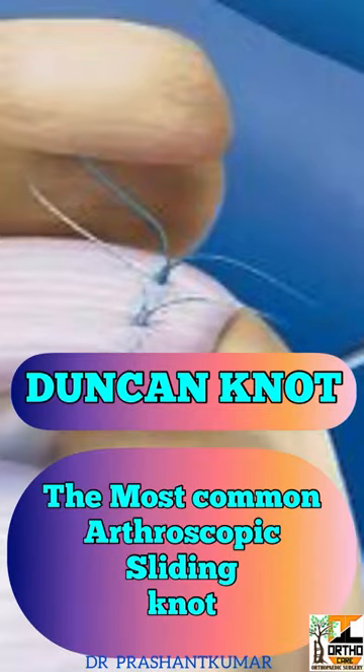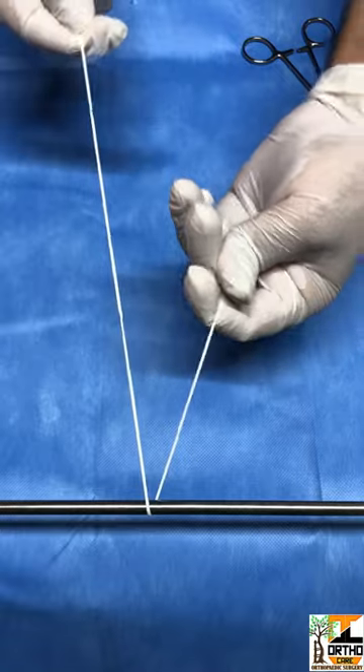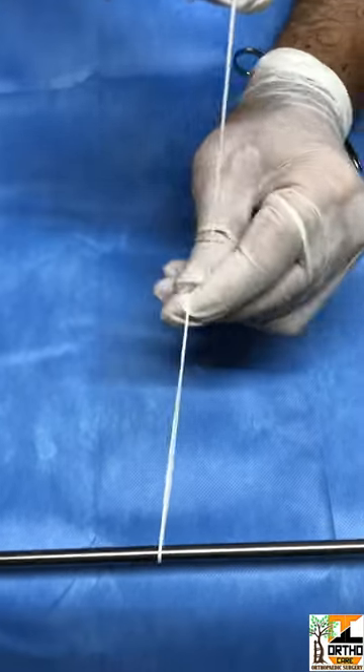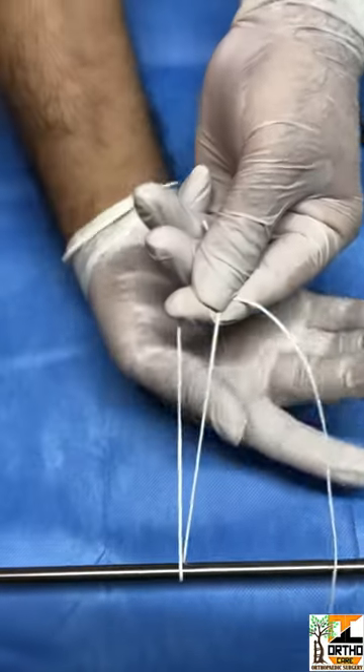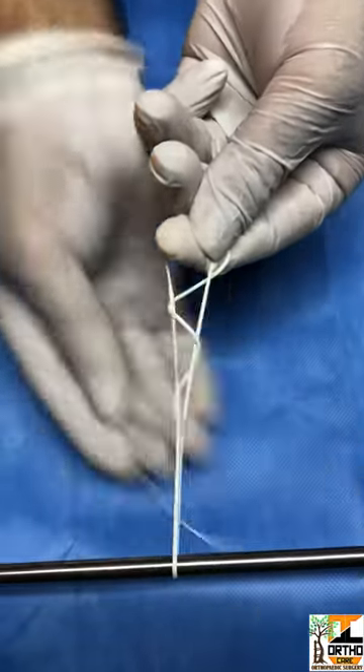The Duncan knot is the most commonly used arthroscopic knot. It has a shorter post limb and a longer loop limb. Just hold a pinch first, then the loop limb is rolled over both limbs — one, two, and three loops.